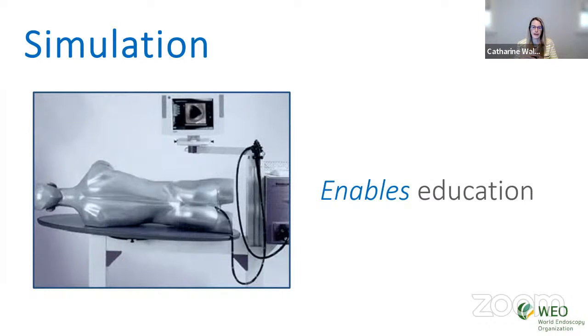So simply providing trainees or practicing endoscopists with access to simulators does not guarantee that they will learn. To be effective, simulation really needs to be integrated into training in a thoughtful and deliberate manner, and grounded in educational theory and evidence so that we maximize its effects in how it can help people to learn.